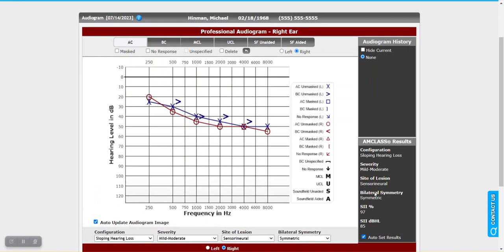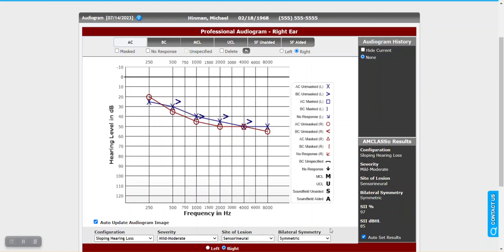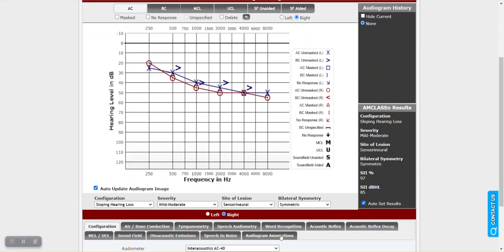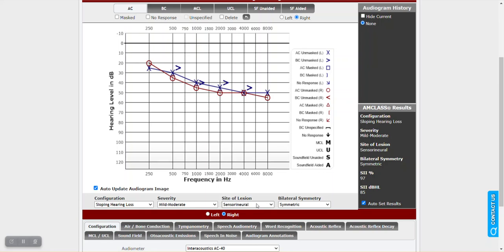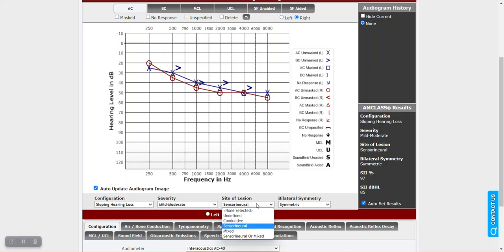But for the rest of this, we're really going to focus on the classification here. So as we can see here, I've entered thresholds for right and left ears, and we can see that the classification has completed. Now if we look in the bottom part here, just beneath the audiogram, we can see those same areas: configuration, severity, site of lesion, and bilateral symmetry. These can be modified at any time. So as I noted, if you didn't have bone conduction but you know you've done hearing tests for this patient over time, you know this is sensorineural or whatever the case may be, you can always choose your option on the fly.